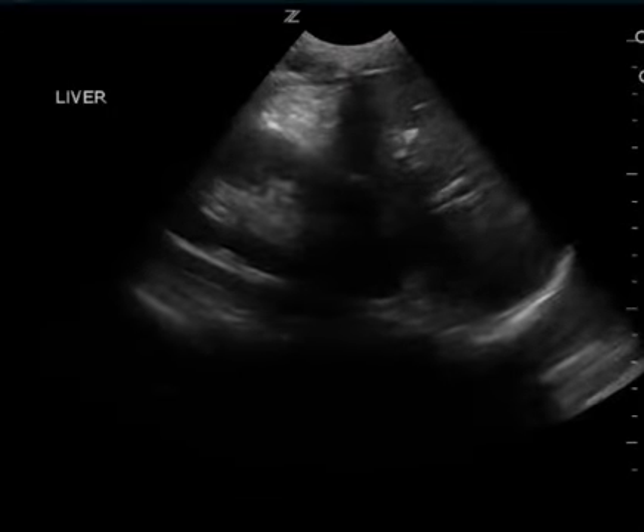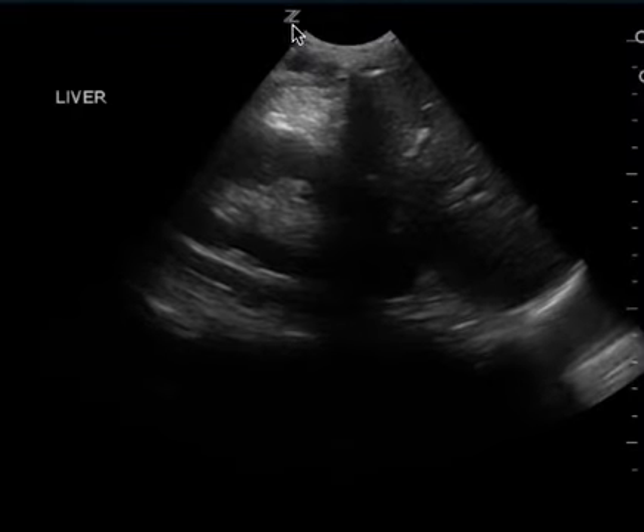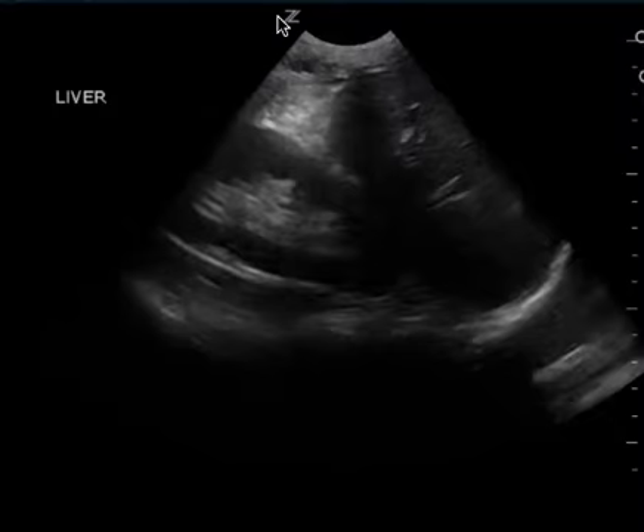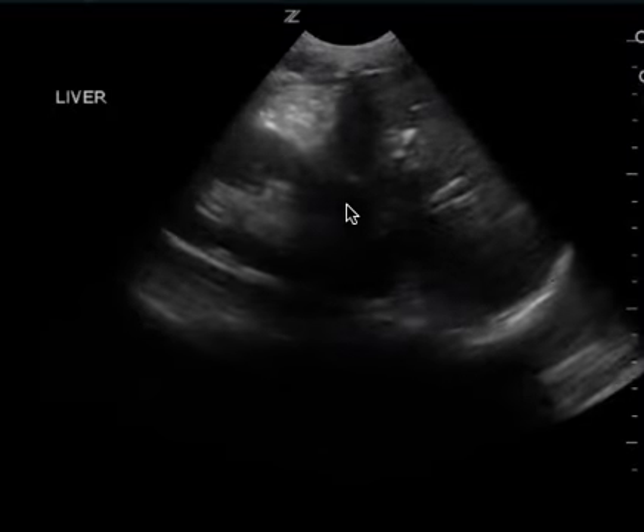There's a FAST exam. This is, I believe, the left upper quadrant. I want you to focus on how you have your probe marker here — it's backwards. You have the indicator to the patient's feet. You want to flip that around.